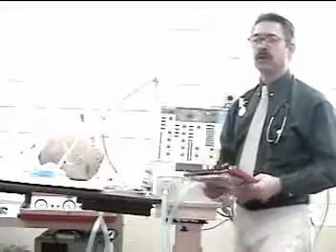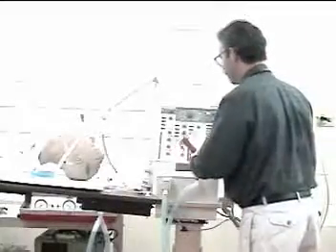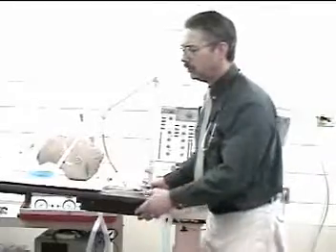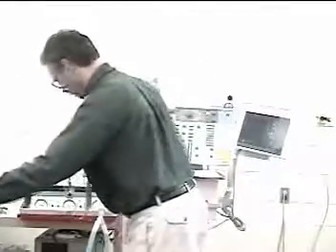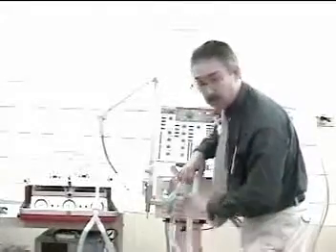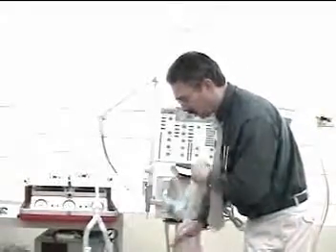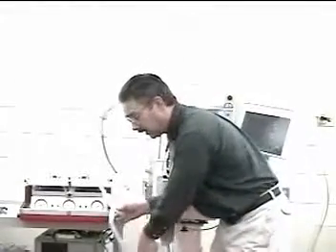Before measuring breath sounds, drain the water out of the tubing. You're either going to milk the tubing to move water to a drain cup, or milk the tubing to a low spot where you can temporarily disconnect the tubing and drain it into a bucket.